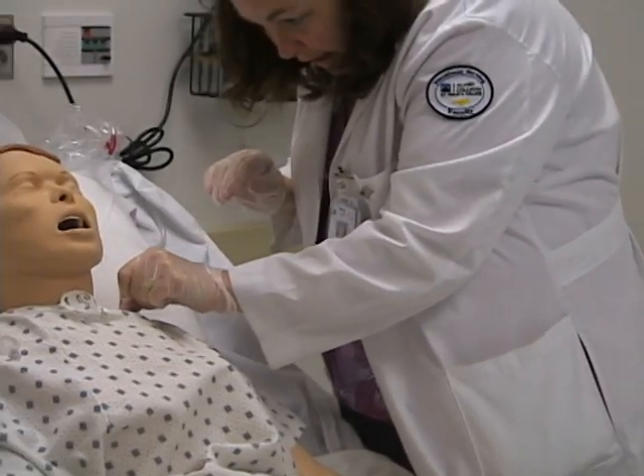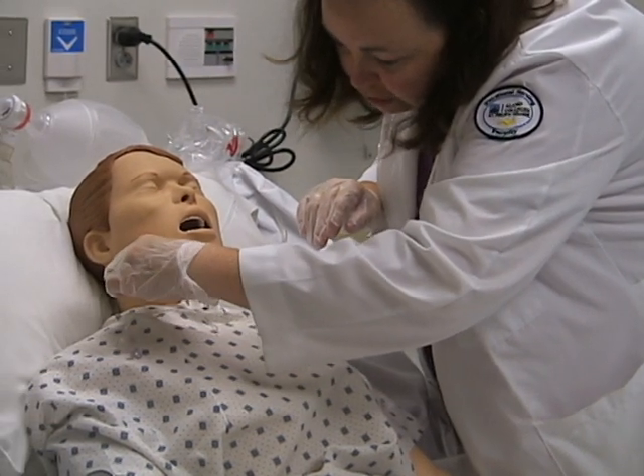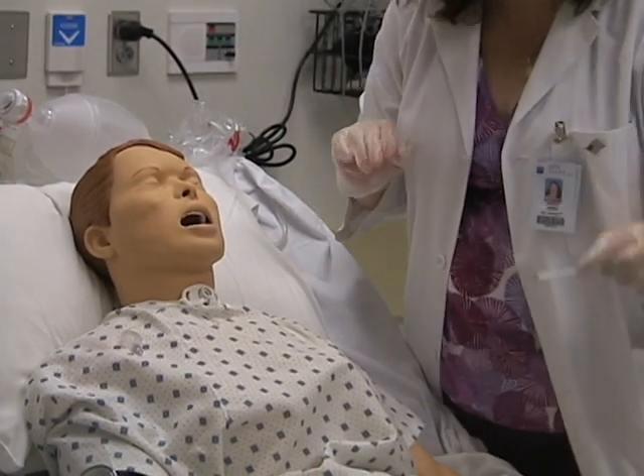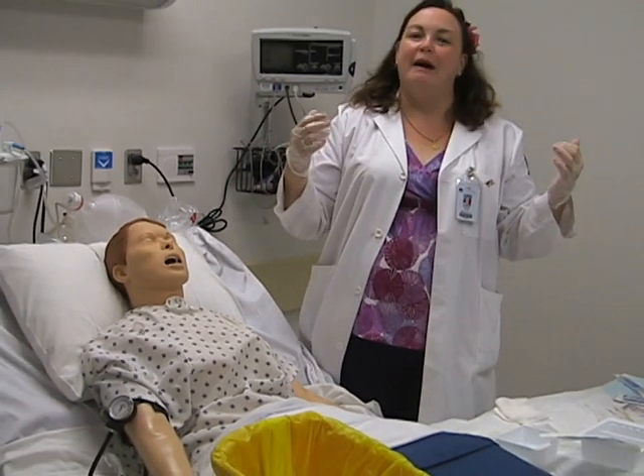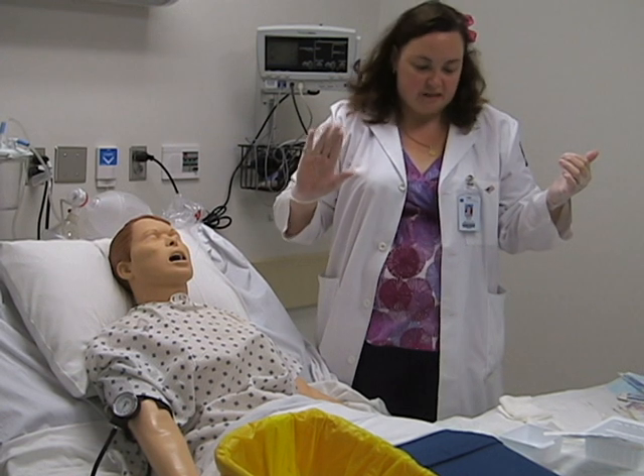Using my sterile hand with some peroxide and water, you can clean around the neck. I like to use a dry one to dry afterward. Make sure that the skin is clean and dry under the face plate, because moist, dark, damp areas tend to grow bacteria. So you want to make sure that area stays nice and clean.